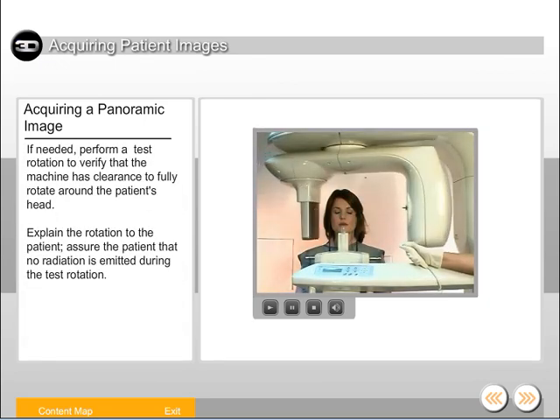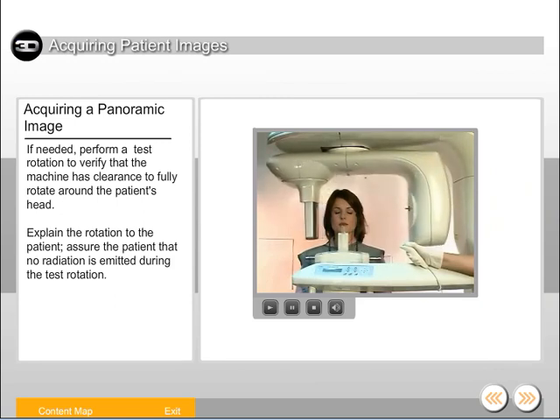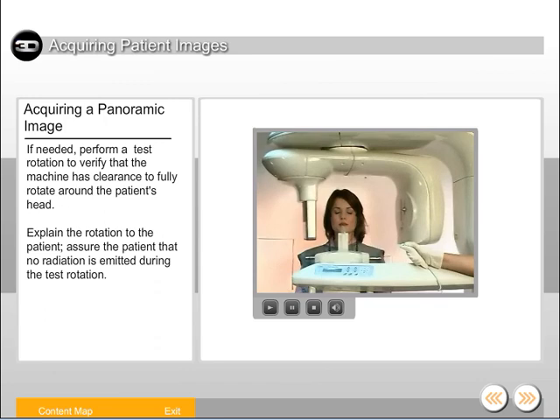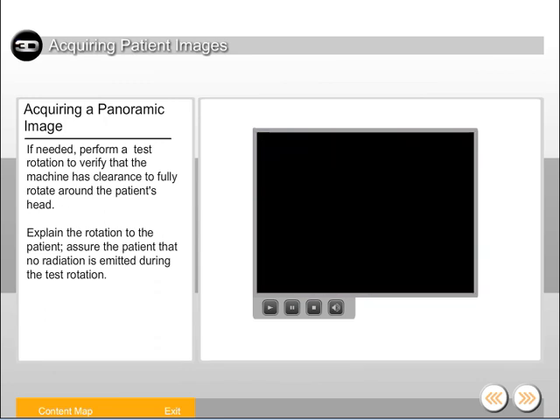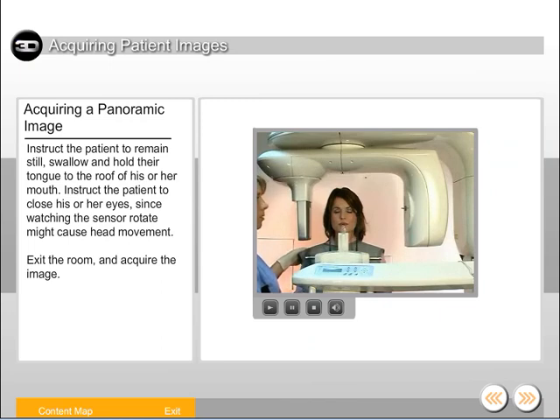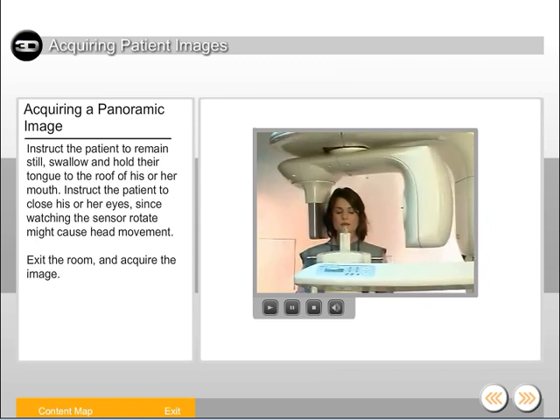If needed, perform a test rotation to verify that the machine has clearance to fully rotate around the patient's head. Explain the rotation to the patient and assure them that no radiation is emitted during the test rotation. Instruct the patient to remain still, swallow, and hold their tongue to the roof of his or her mouth. Instruct the patient to close his or her eyes, since watching the sensor rotate might cause head movement.